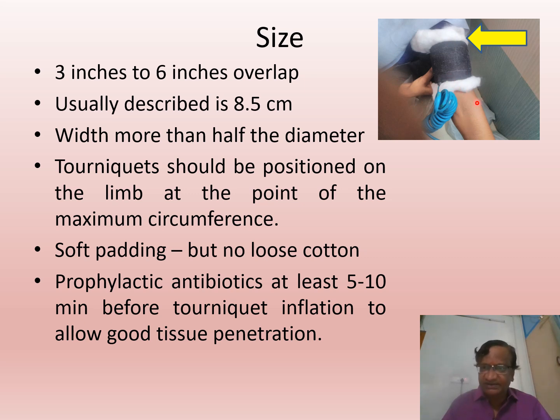It should not go like here. Soft padding should be there, but no loose cotton like here. There should not be loose cotton. All should be cut and tied inside, tucked inside.